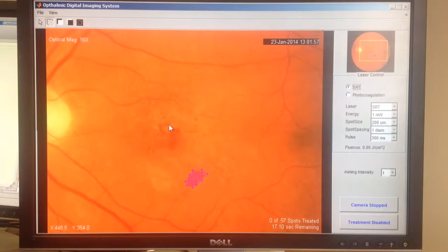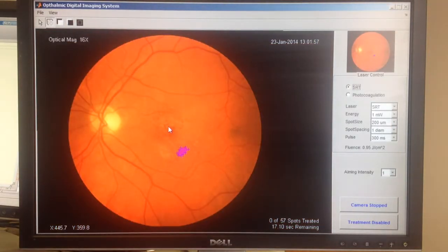And you can have different colors for different treatment times. So 2 weeks ago could have different colors than 4 weeks ago versus what you've just currently treated. So it's basically a way of tracking the specific locations where you have treated, mostly with SRT, because with coagulation you can see the burns, but with SRT it's going to show you where you have treated in the past.